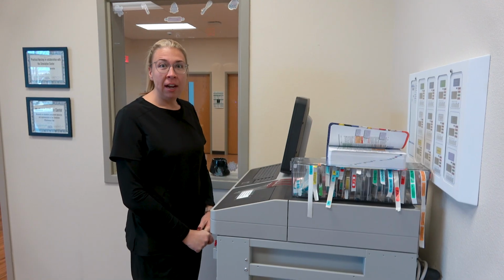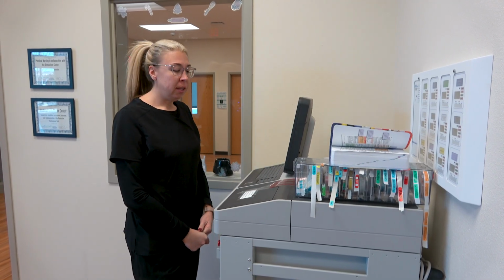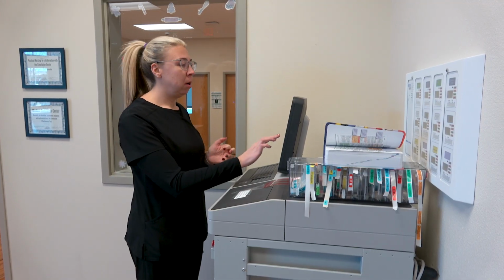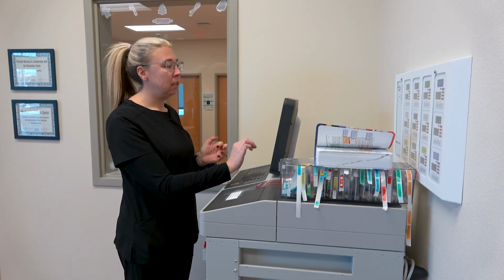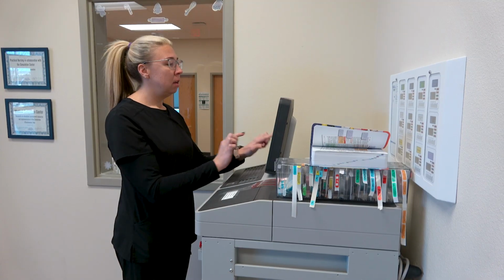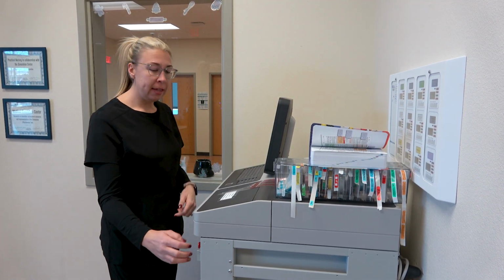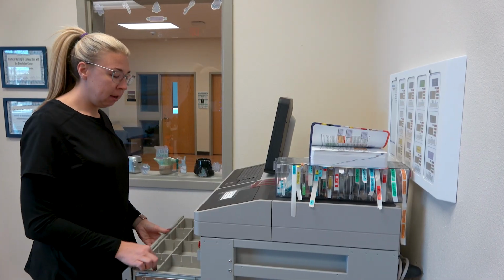So today we're going to give an IM injection for Mr. Smith. He needs some IM Toradol. So I'm going to come to the Omnicell. I'm going to go ahead and pull up his name, verify that the medication is on here, and I'm going to go ahead and select that and pull it from our Omnicell.